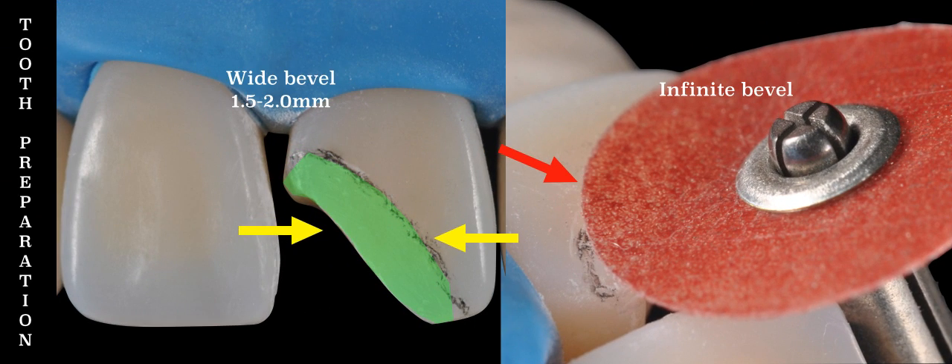What I recommend doing is creating on the facial a 75-degree bevel, one that extends 1.5 to 2 millimeters in width. This bevel will give us a soft transition from the fracture line, as seen on the left photo.